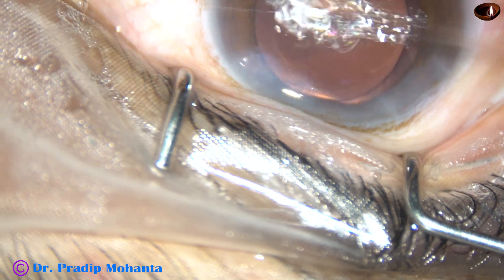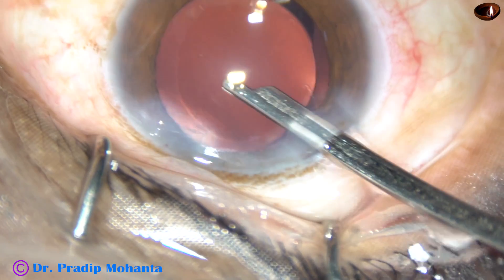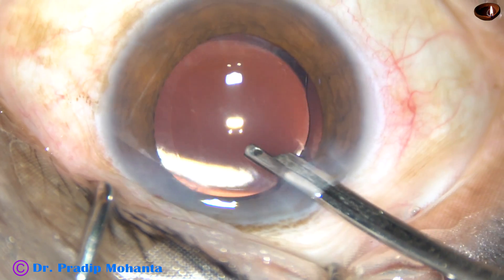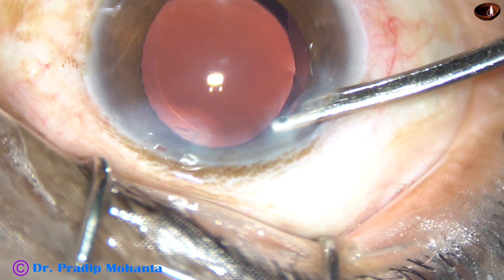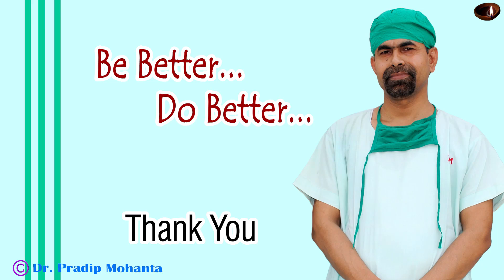This is closure of the side port by stromal hydration and this is the final lavage of the anterior chamber. I do this religiously — I want to leave pure clean BSS and nothing else at the conclusion of surgery. The surgery is concluded. Thank you very much for your attention. Hope this video will help you in developing your surgical skills. The key message: don't try to catch hold of nuclear fragments sitting over the posterior capsule — lift them up and then consume them. Thank you very much.